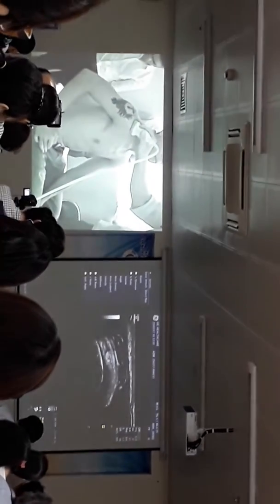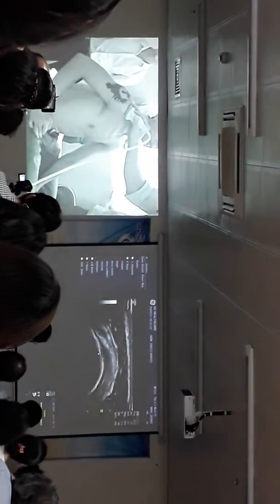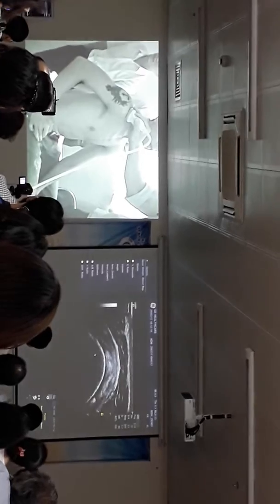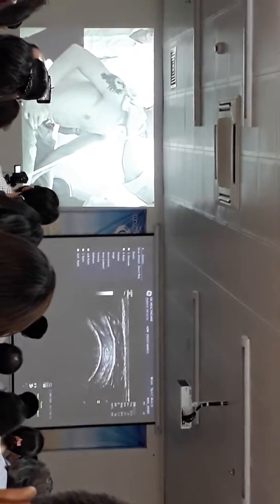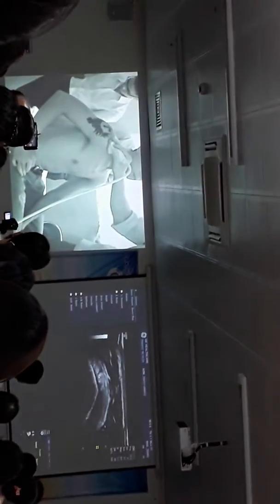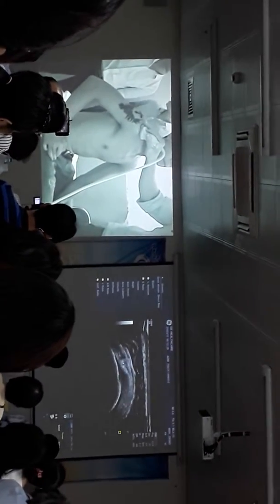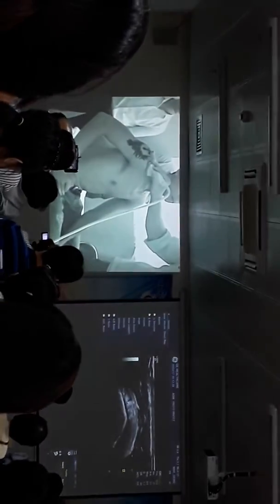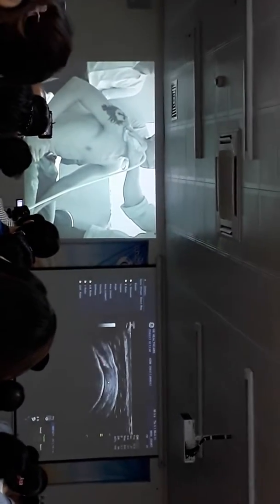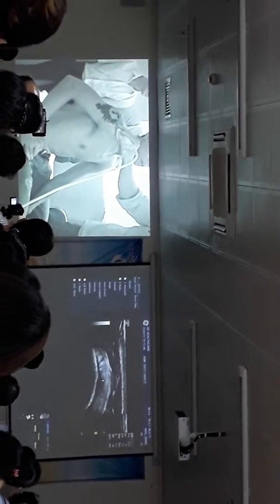From here you can see a slightly different direction of fibers coming in onto the greater tuberosity. So this is the posterior supraspinatus tendon, and this is the infraspinatus tendon junction. Just because of where these occur, it can look a little bit more heterogeneous than the other tendon. So just take care not to misinterpret that as tendinosis.